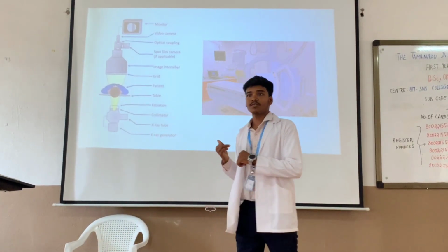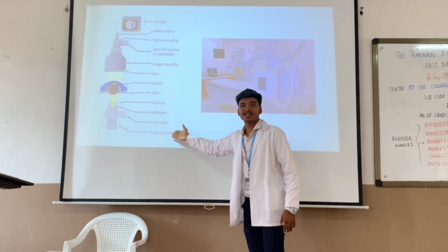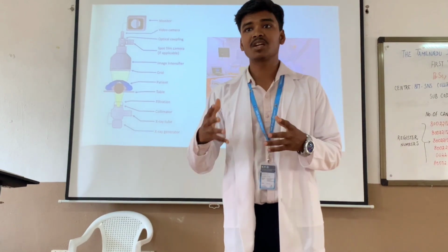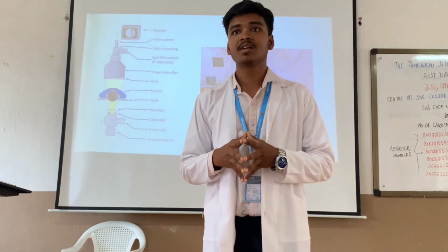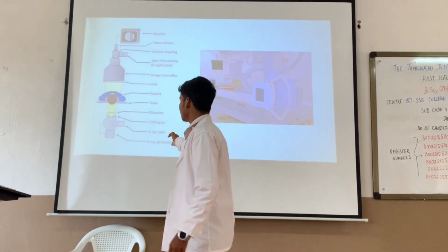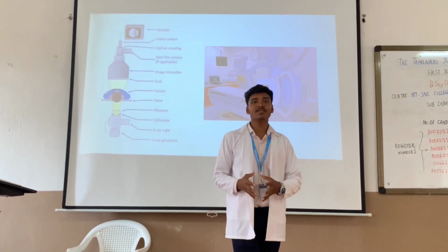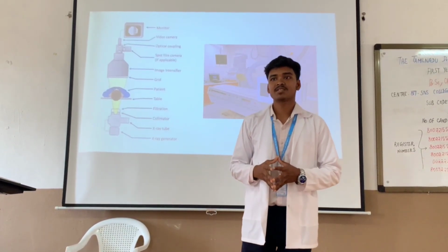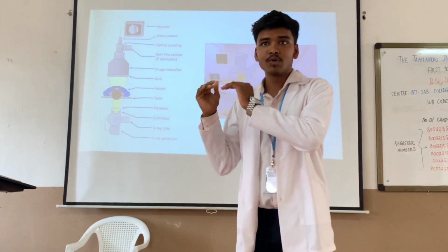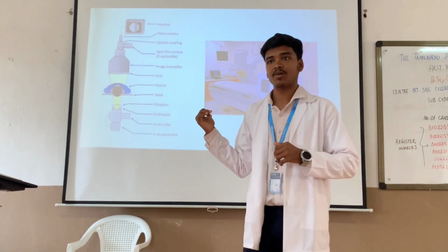What are the components of image intensifier fluoroscopy? First, the X-ray generator for current production, with selection of KVP and MA parameters. The KVP parameters are selected. For a constant power supply, we use the X-ray generator. Then the X-ray tube for the production of X-rays, the same as in radiography equipment. Fluoroscopy also has the same parts, like anode and cathode. It's a rotating anode X-ray tube.